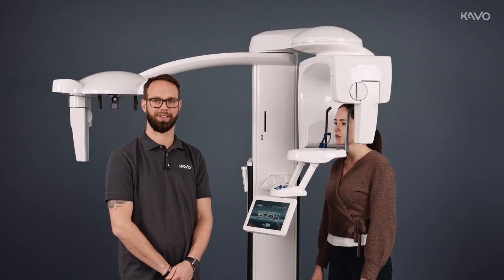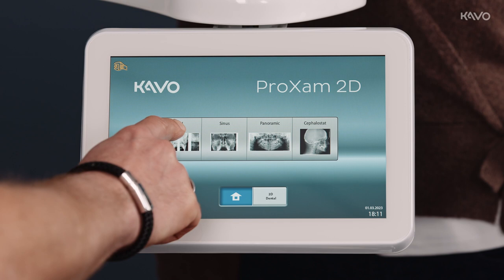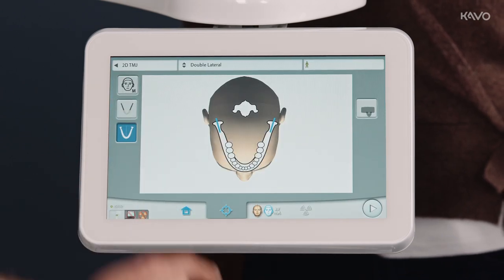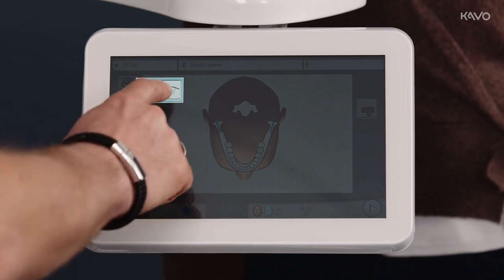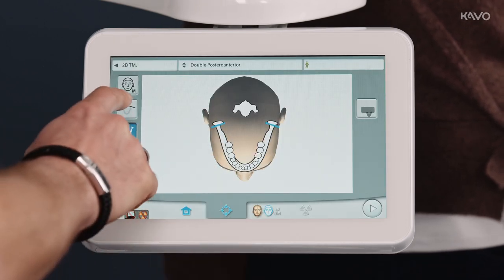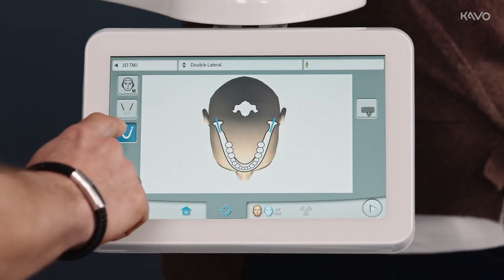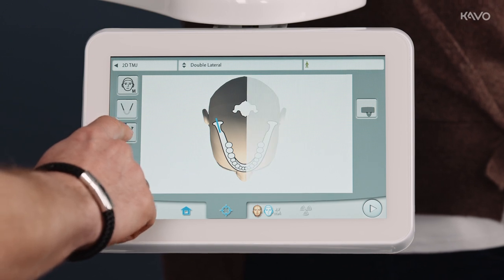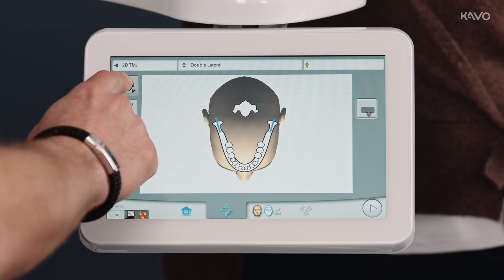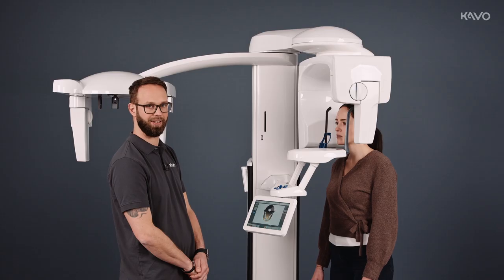To start the temporomandibular joint imaging process on our ProXam 2D, we go to temporomandibular joints on our display. Here we can choose double lateral or double posterior anterior. We can select a side or image both sides at the same time. Again, we are given the opportunity to pre-select the patient type.